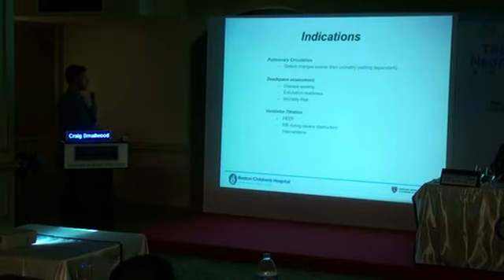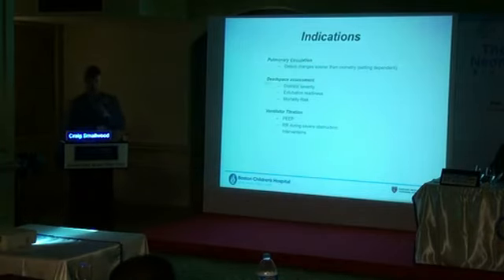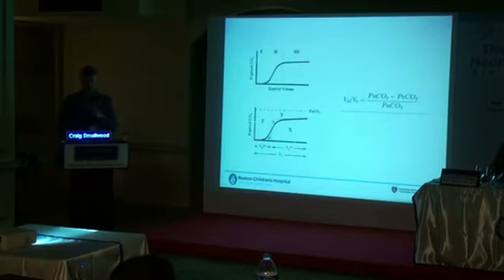Indications, pulmonary circulation, dead space, and vent titration. I showed you a couple of interesting illustrations of that earlier. And I think one of the last things I'm going to leave you with is dead space. We all know what dead space is. And how do we calculate dead space? You guys learned about this, I'm sure, in school.